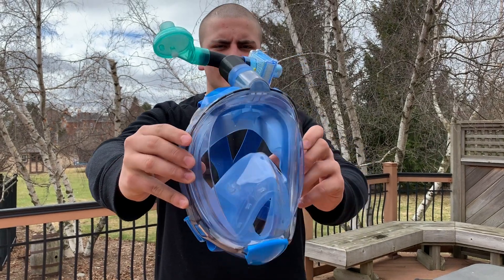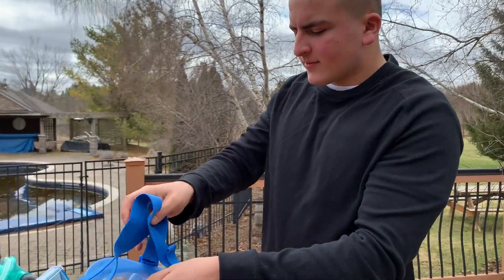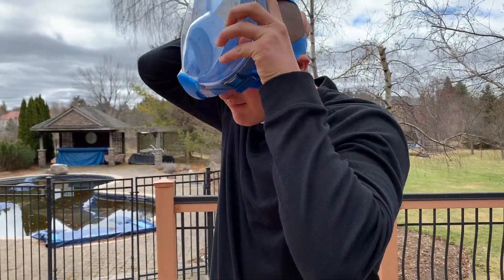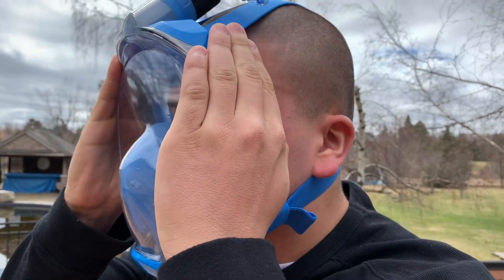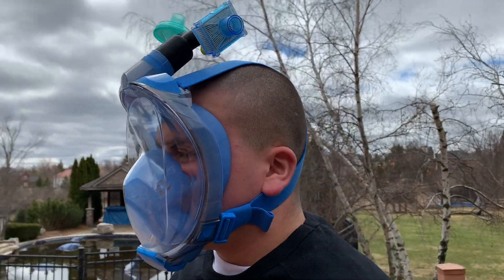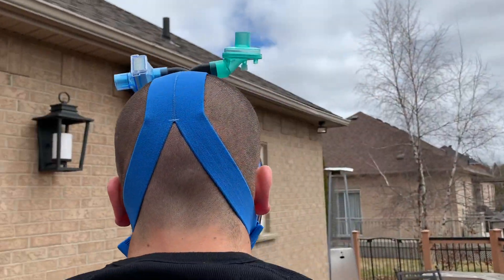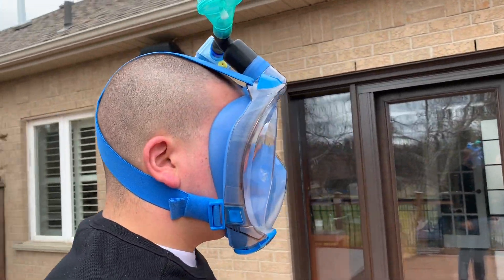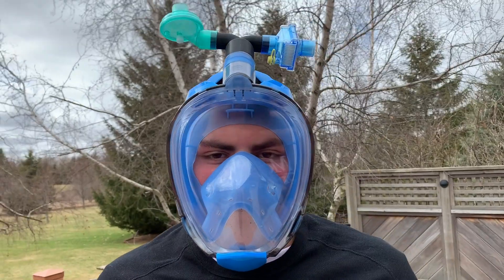Our solution is through a unique scuba mask that an Italian doctor was using to fight COVID-19 on the news. The mask provides a watertight seal not only around your eyes but around your entire face. The only air passage is at the top of the mask that resembles a horn. What we did is we unscrewed the horn and replaced it with a 3D printed T-shaped piece. On each side of the T, we attached anesthesia filters that can substitute N95 filters when they are unavailable.